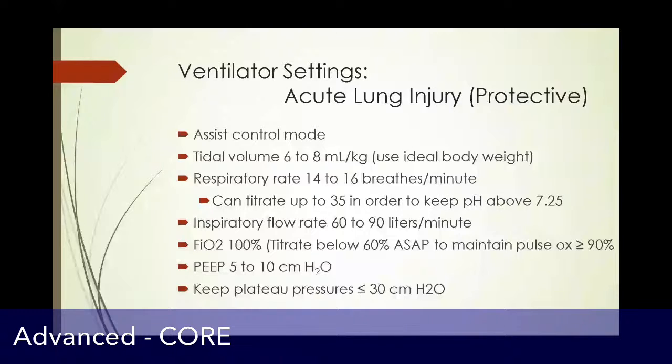Use an inspiratory flow rate, again, somewhere from 60 to 90 liters per minute. FiO2, again, you're going to start at 100%, titrate down below 60% to maintain an oxygen saturation greater than 90, 92%. A PEEP of at least 5 up to 10 centimeters of water.